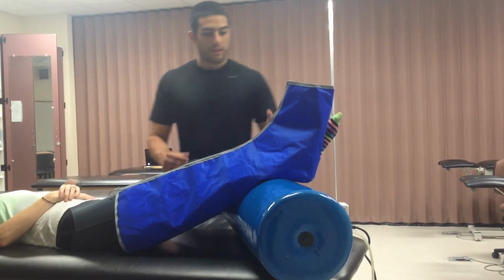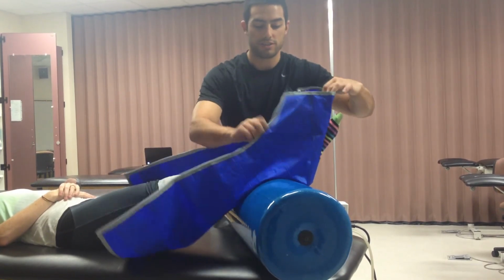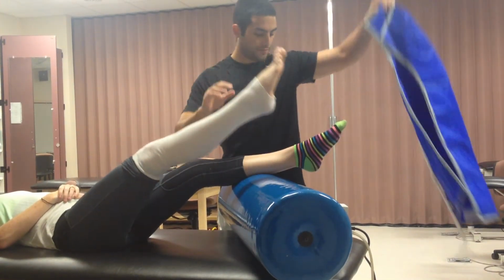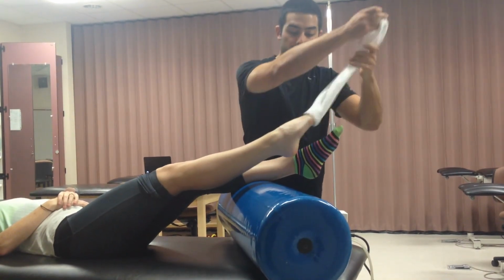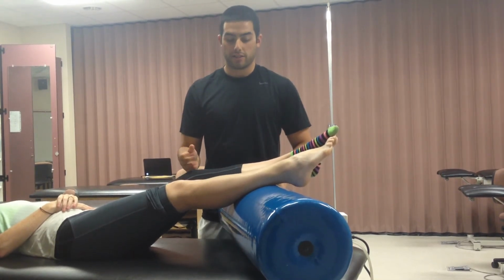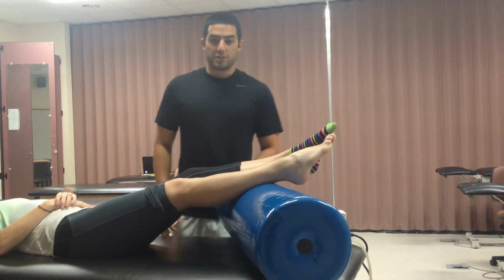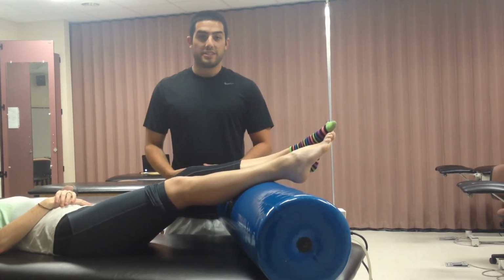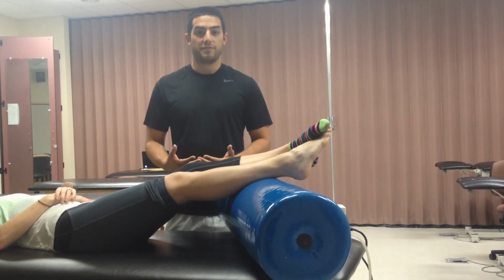Following the treatment, I will remove all the compression sleeves of the unit and the compression garment, and re-inspect the area for any abnormalities. Expected outcomes of the treatment in the short term is to not find any thrombosis, and in the long term is to continually prevent the deep vein thrombosis.